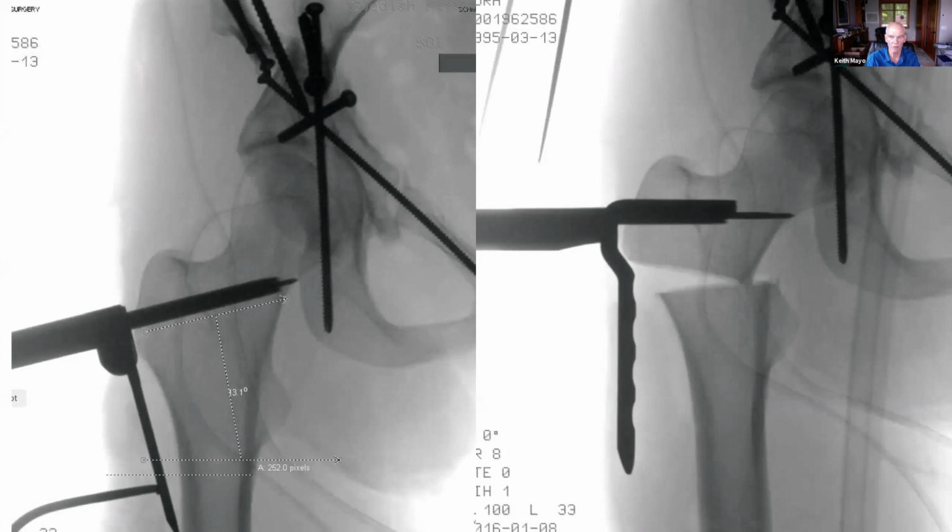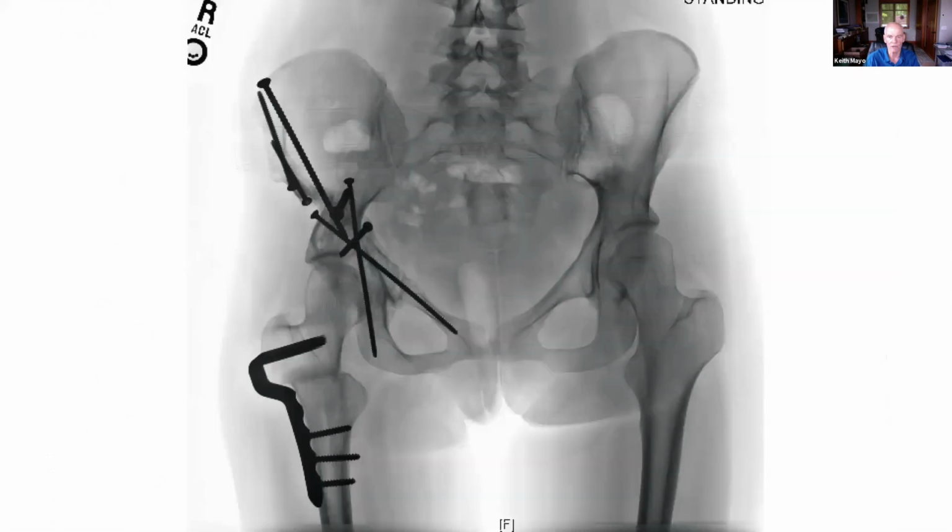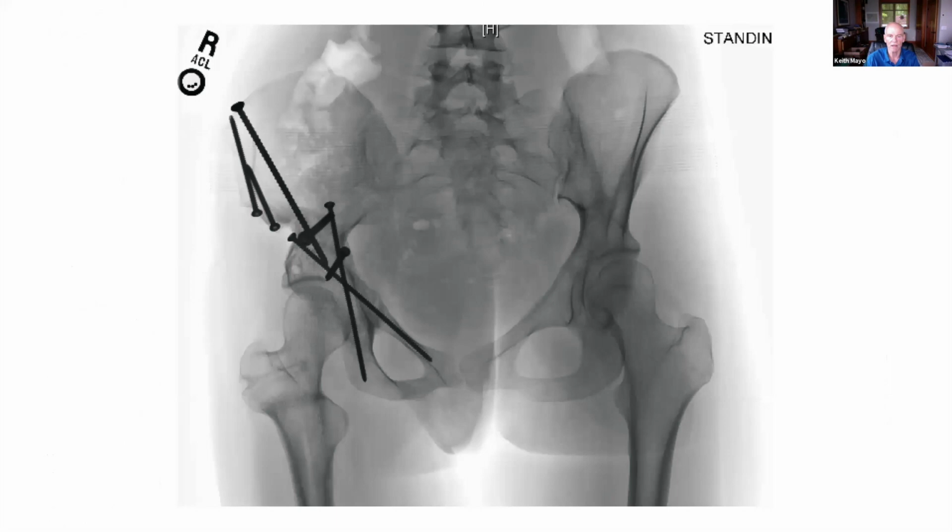So this would be the opening wedge purely. So we have a point of medial contact and a pure opening lateral wedge. And then we put an interposition graft in. And as we set that up at the end for doing a tensioning using the articulated tensioning device, what's happened is that I've actually crushed the metaphysis through this allograft wedge, and I've lost part of my correction with the tensioning. She probably had an eating disorder, and so her bone was not robust, shall we say. And so this is what she ended up looking like initially, and then finally at healing.